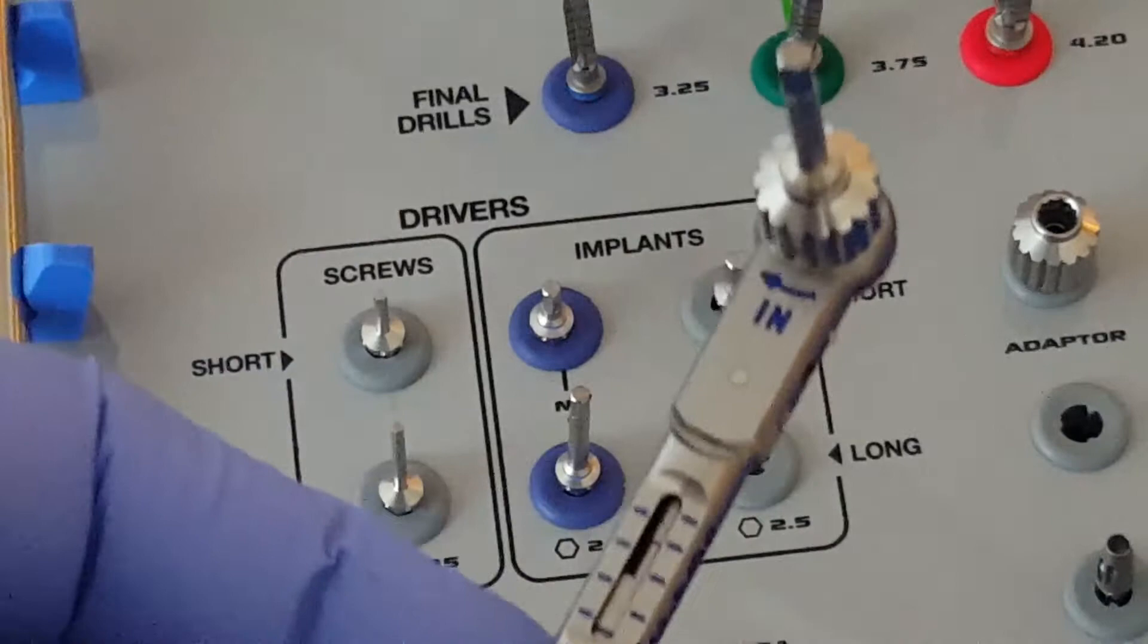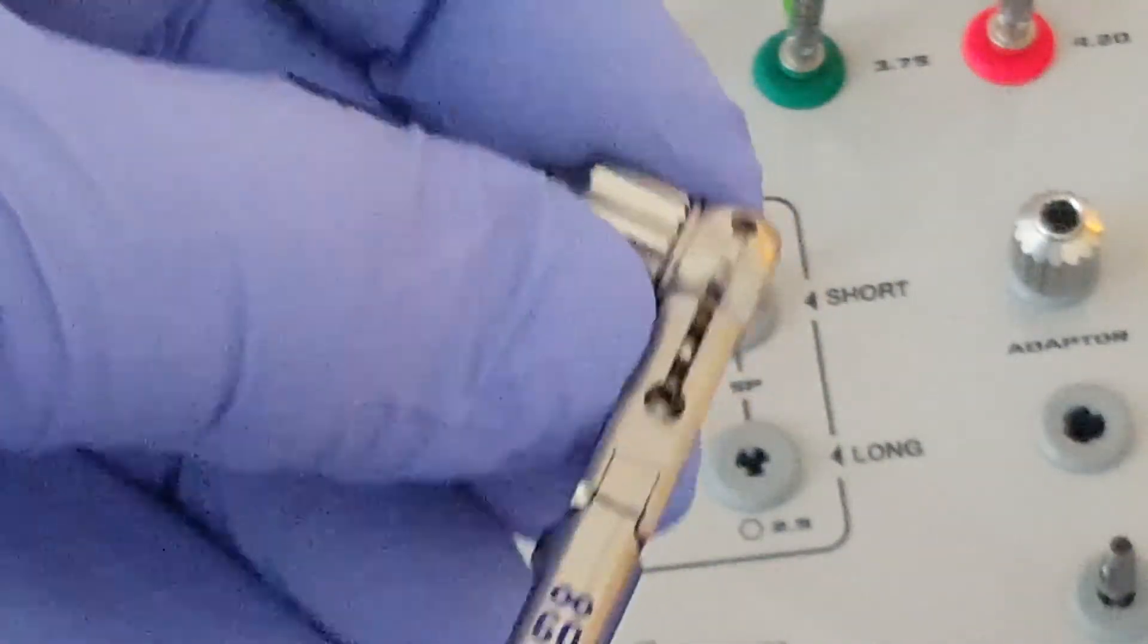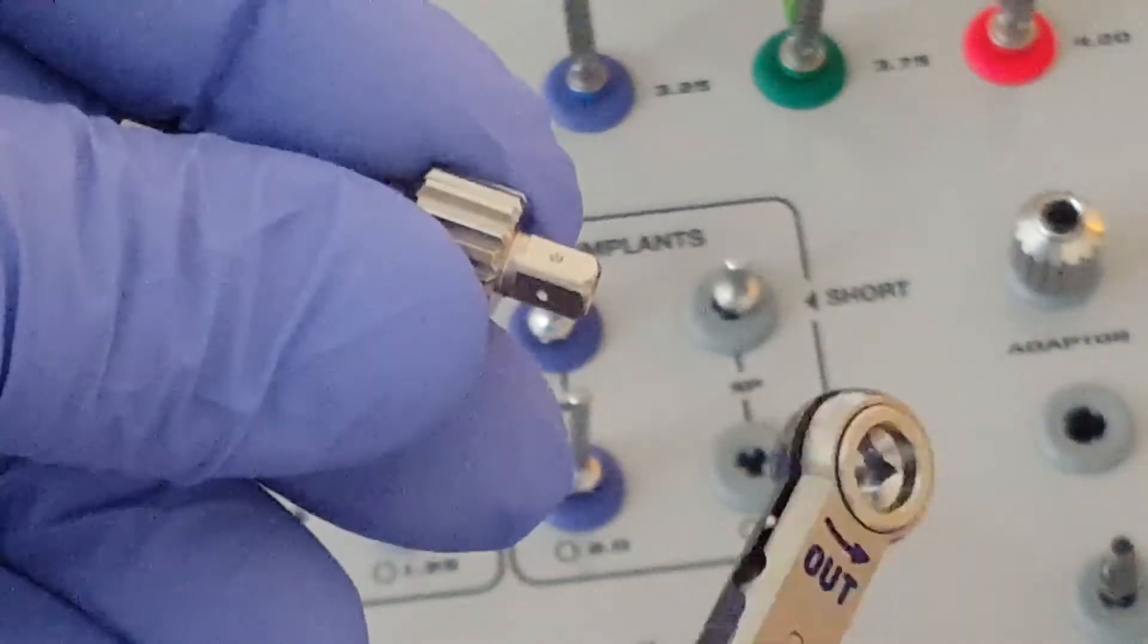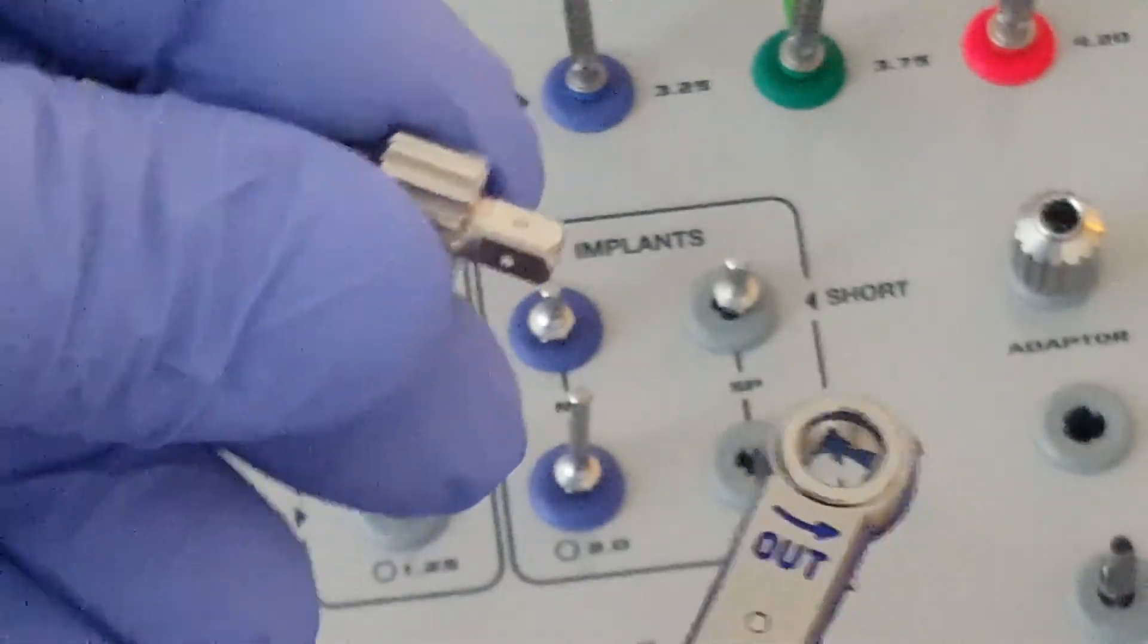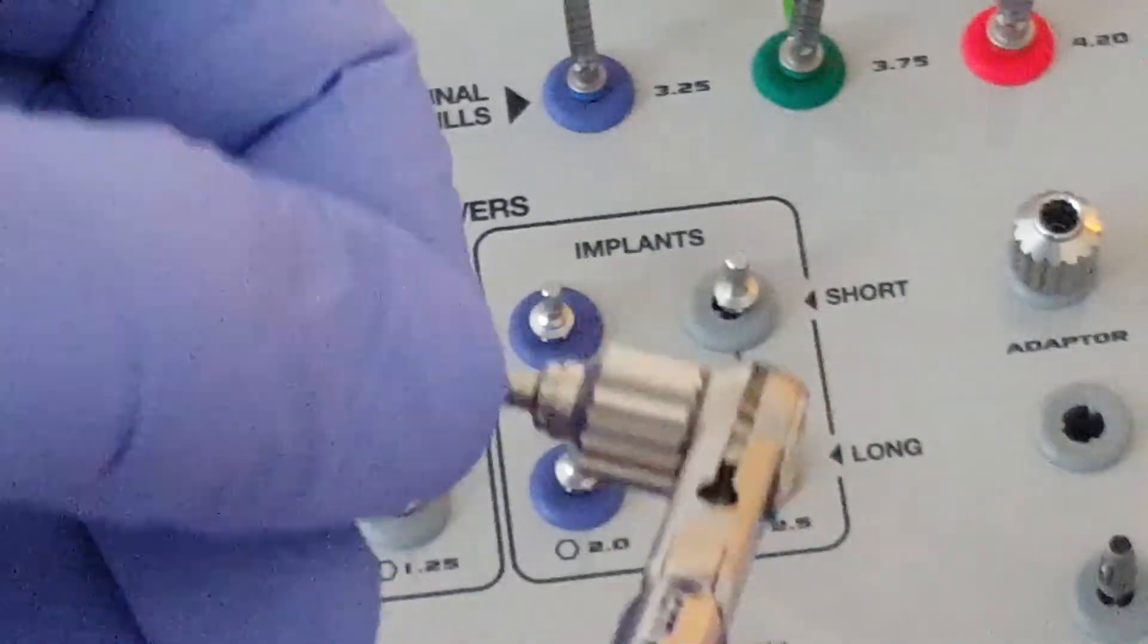If you want to reverse the implant, then simply remove the adapter with the implant insertion key, go to the side that says out, reinsert it, and it will now work in reverse.